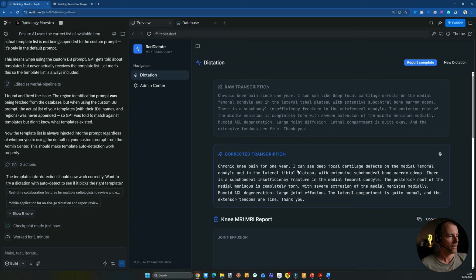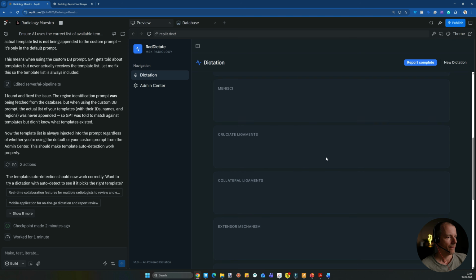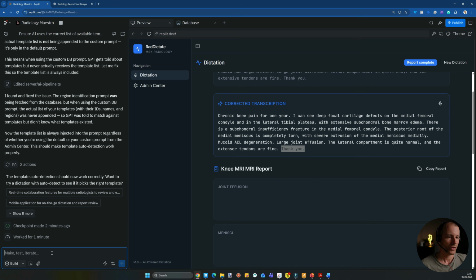It's now identifying it's a knee. It's correcting this. So 1 year, deep focal cartilage defects on the medial femoral condyle and in the lateral tibial plateau, which it corrected correctly. With extensive subchondral bone marrow edema, there is subchondral insufficiency fracture in the medial femoral condyle, posterior root of the medial meniscus completely torn with severe extrusion of the medial meniscus medially. Also a large joint effusion. That's good. The lateral compartment is quite normal and the extensor tendons are fine. Thank you. I don't know why the thank you is still there. Anyways, while it gives an impression, that's good, but it doesn't really apply the JSON stuff.